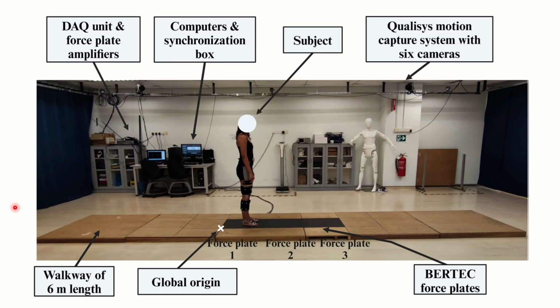You would also have to decide on what equipment you're going to use. That's what equipment that's already available and what equipment you need to purchase. And even things like consumables, surgical tape, alcohol swabs, or even motion capture markers. You should also utilize the space such that the participant feels comfortable, is not claustrophobic, and has enough space to walk around and move around and perform the experiment. You should keep your workstation in a suitable location such that you can monitor all your equipment and your readings while observing your participant and engaging with them and talking to them to make sure they feel comfortable and they know what they're doing throughout the experiment.